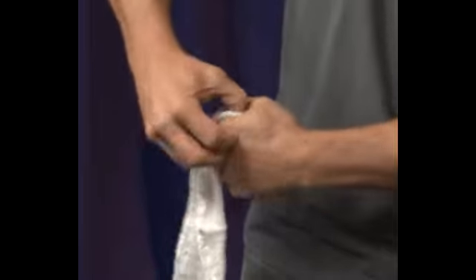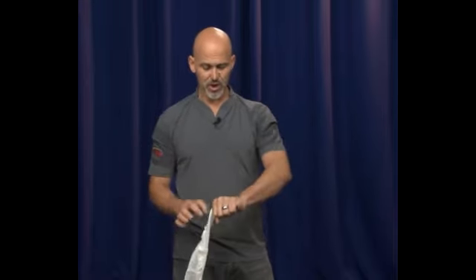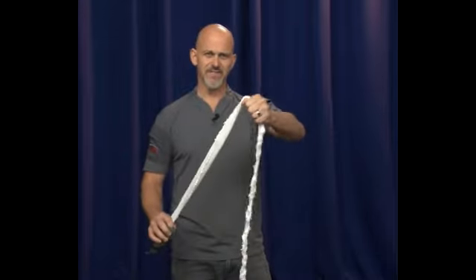Let's take a look — that's pretty good. That's a lot of material packed in there, and obviously we still have some material left. A larger wound, you might be able to get more into it. But as I open up my fist, you're going to see just how much material was inside of that fully clenched fist.